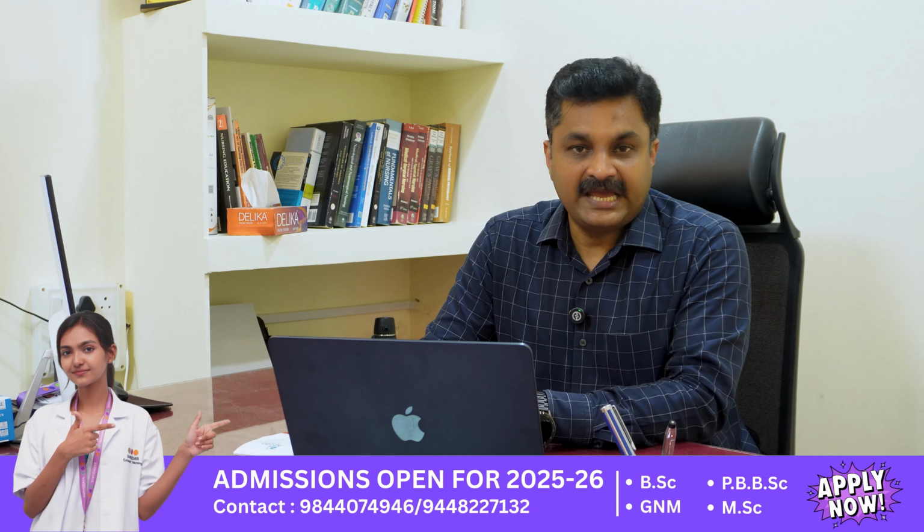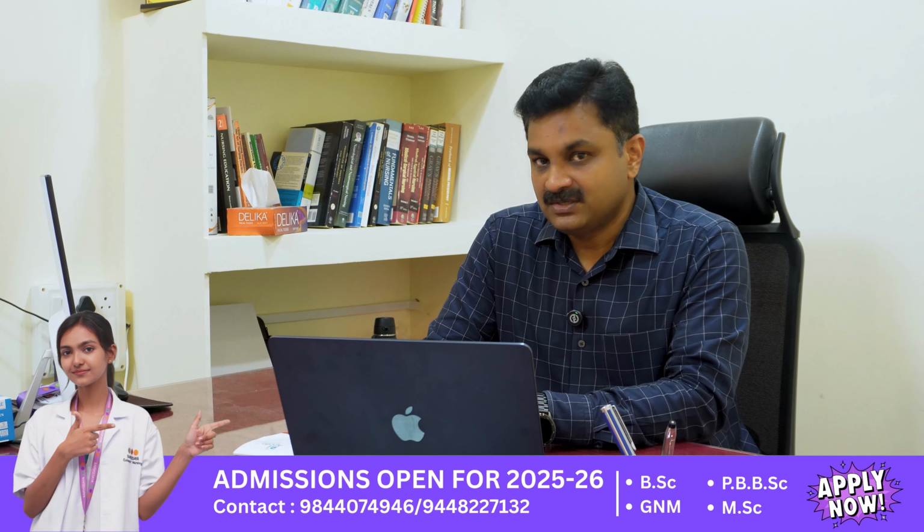You have to understand one more thing. There are certain times the AED will say no shock advised. That may be a non-shockable rhythm, like asystole or pulseless electrical activity. In such a situation, the AED will say no shock advised. So it is our responsibility to start with compressions, because that is a non-shockable rhythm. So I hope that it is clear for you.